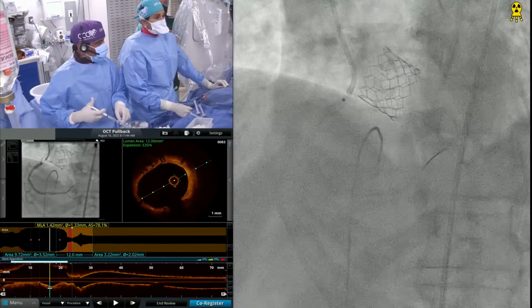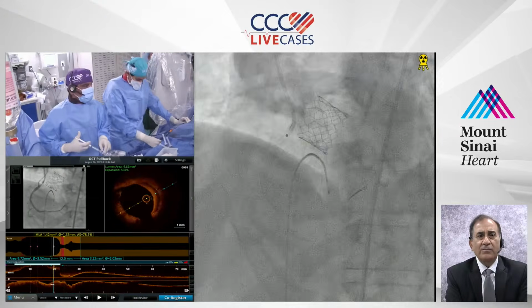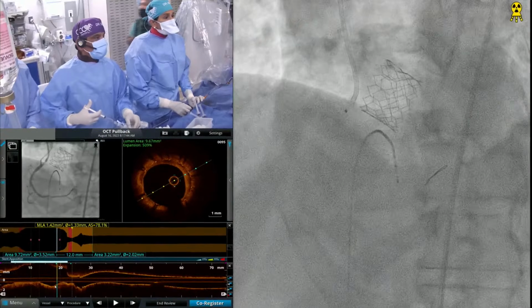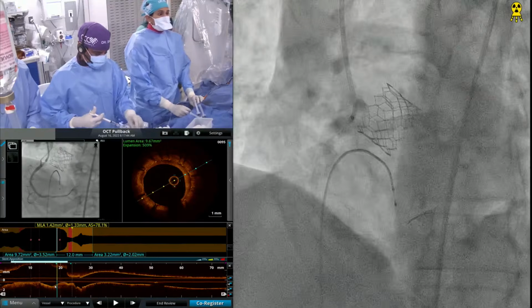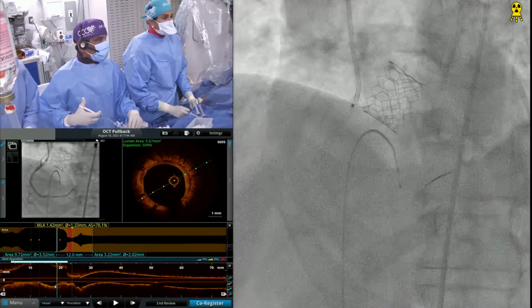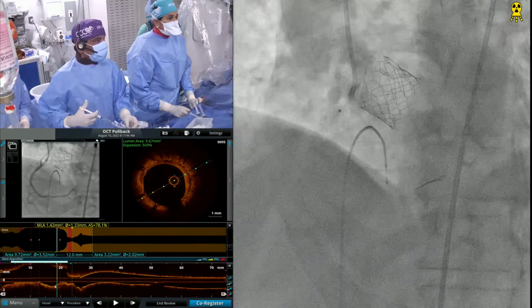One of the common practices I used to have was to, as the laser is advanced, slightly pull back on the wire. Slightly. Just flush a little bit. That's it. I'm giving a little dye now. Okay, it crossed. You want to come out a little bit or you're done? It's the most of the ostial lesion, right? Right. Yeah, also just very short.